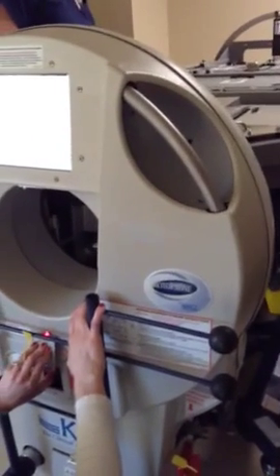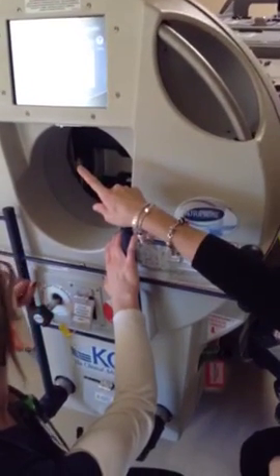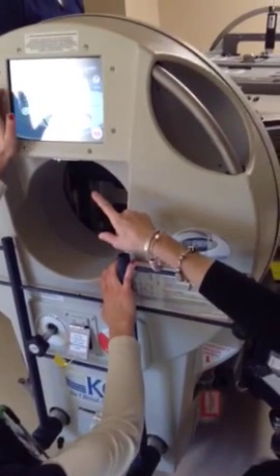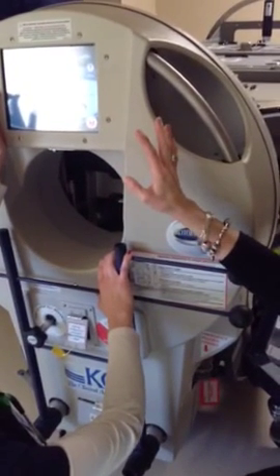Okay, all right. Now bring this most to the center. I'm going to re-engage this right here. Let that go. Hit cancel up there. And then check tubing, airway, head support. And if you had power, you could just start going back, okay?